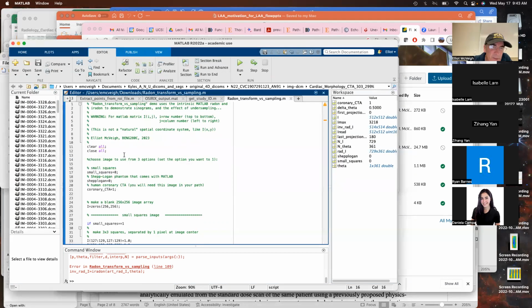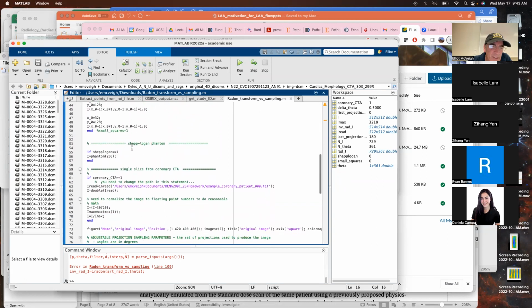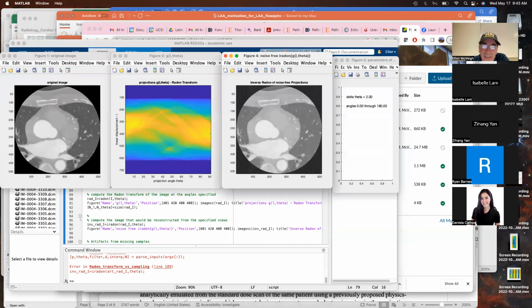And so what happens if we say we want to do this with a quarter of the radiation of that one, we'll change this to 2. And it's still a very reasonable picture. It does have a lot of this underlying streaking structure. It's not really noise, it's an artifact as opposed to noise.